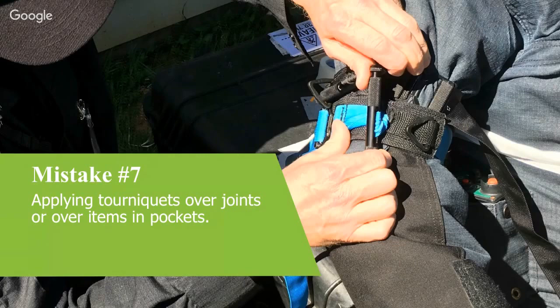So we know that if you place a tourniquet over a joint, just due to the bony structure, it's just not going to be effective. Same if you apply that tourniquet over something like a phone or a notebook in a pocket. You're just not going to have that compression around the tissue to stop that bleed. So we definitely want to make sure that we remove everything from their pockets and not place it over the joints. So we've already talked about the high and tight versus just proximal to the wound.